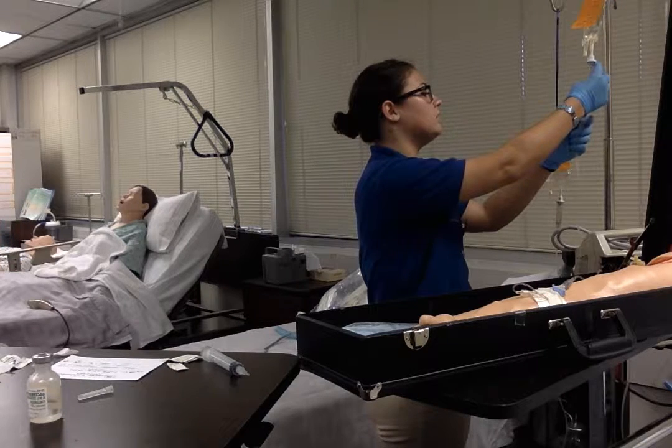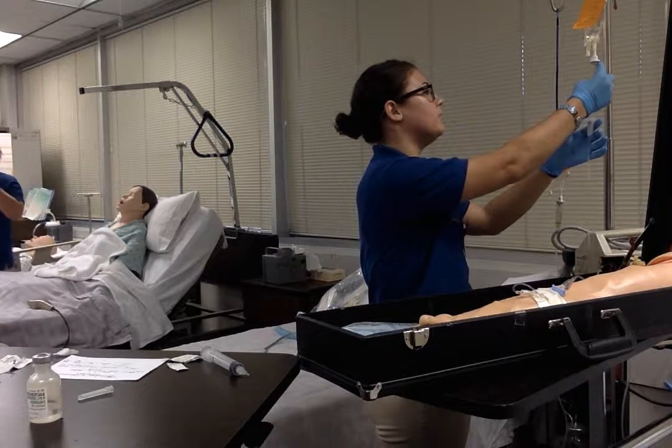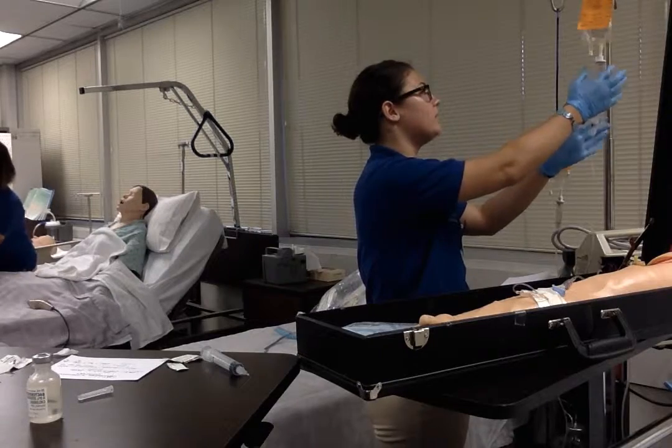I'm going to stay. Okay. And now we have it at the correct spot, we're going to leave it there.